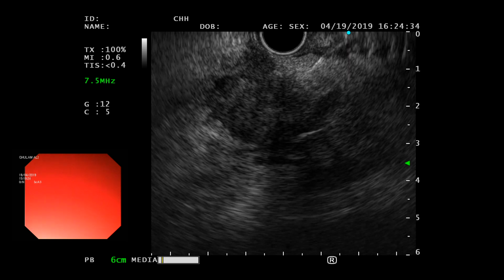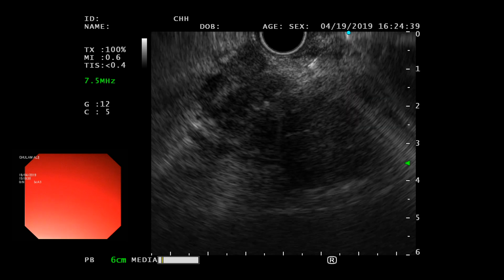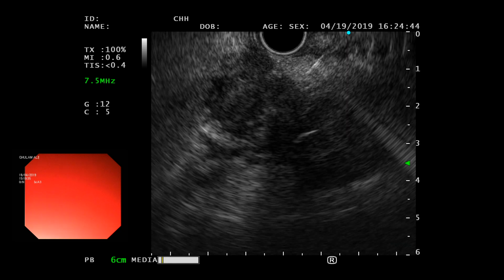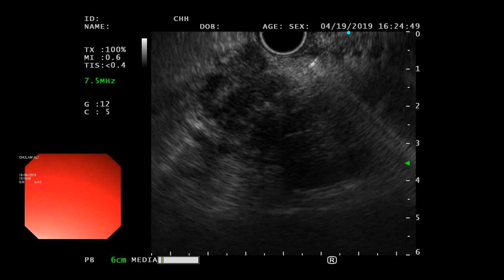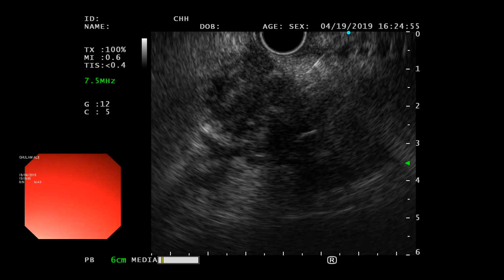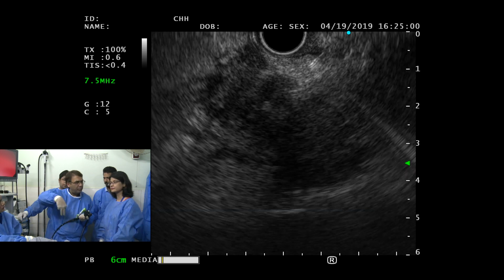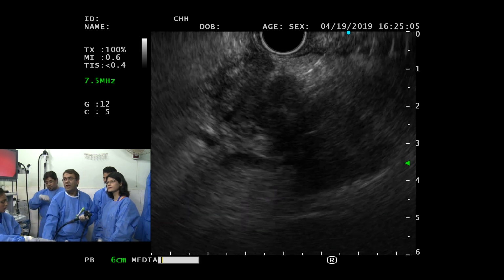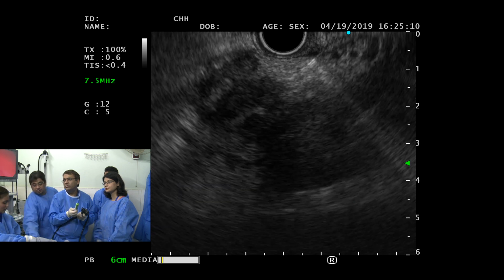Okay. After puncturing the gastric wall, you stabbed, right? Did you puncture first? No, I did not puncture, I only anchored it, because you cannot puncture the gastric wall just by doing this. It has 3 cutting edges. You sit on the wall, those edges go into the mucosa, so you anchor yourself. The hardest part to get through is the muscularis propria, and that really needs a quick stab, especially with this needle. Okay? Reema is getting weak, you hold this firmly.